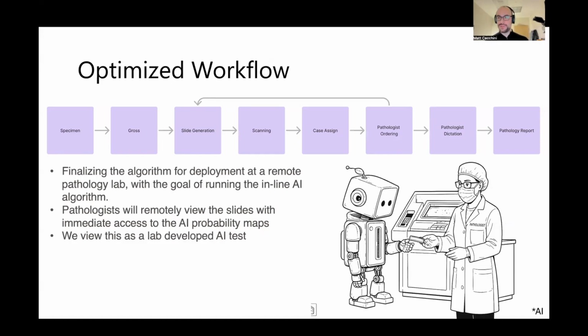Yes, you still need to do some QC and quality assurance as you're doing this, running positive and negative controls through them to make sure there's not a drift in your H&E variation that's changing it. But I think we need to lower the barrier for some of these getting into clinical practice.